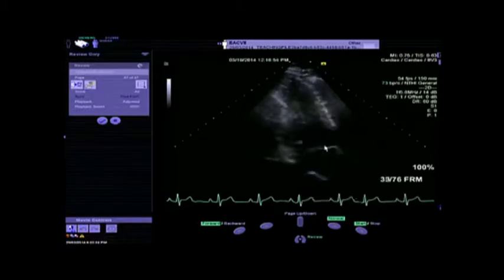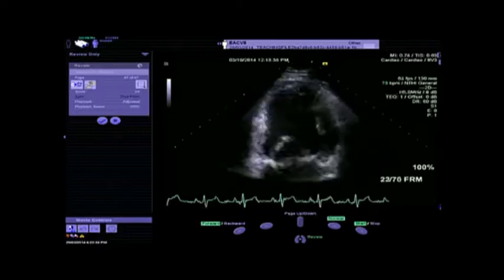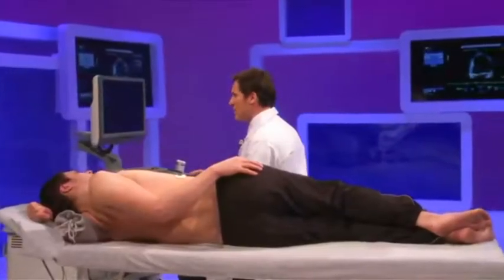So just to summarize, if I turn back to the four-chamber view, what is important to know about the repairability is first the mitral annulus diameter, and I will measure this in a minute. Secondly, the scallops that are involved, and in these patients both leaflets are involved in the disease process.